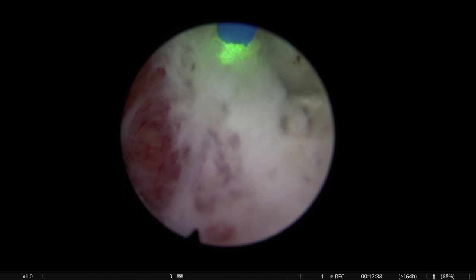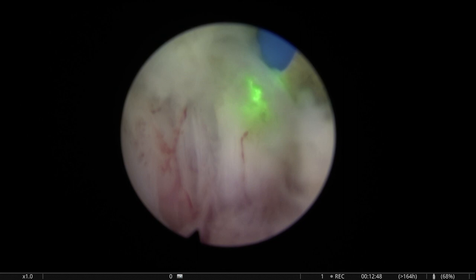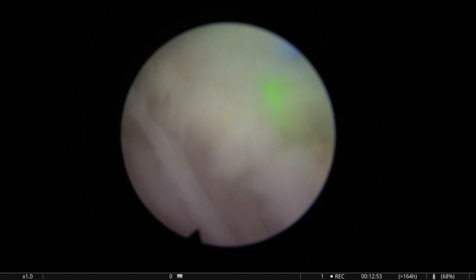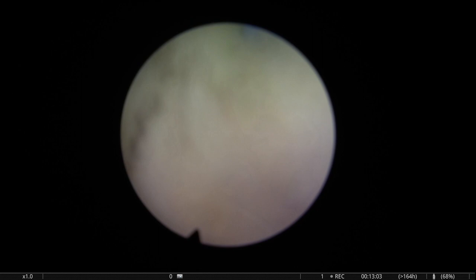I mean, in this case, because we didn't have a beautiful plane, but we had a lot of this nodular, let's say, tendency, you know? So here, this is still 12 o'clock fibers, a little bit lateral, and I'm cutting very slowly, because with this low power, with this low frequency, you can't cut very fast, you know.